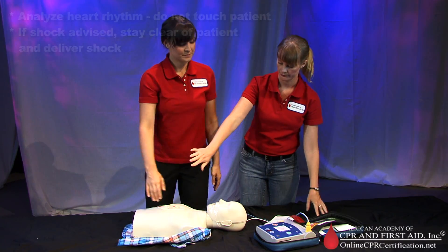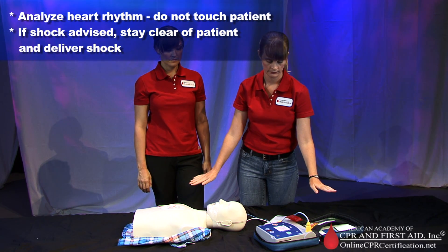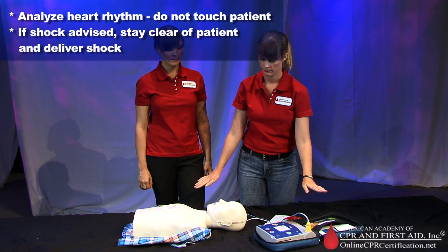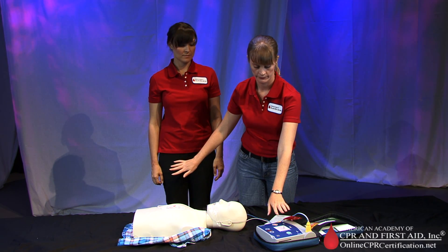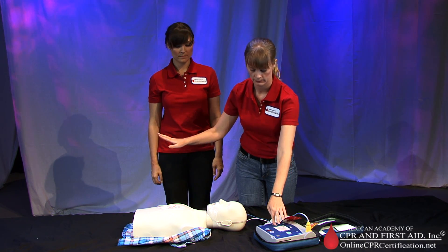Analyzing heart rhythm. Do not touch the patient. Shock advised. Charging. Stay clear of patient. Deliver shock now. Press the shock button — shock delivered.